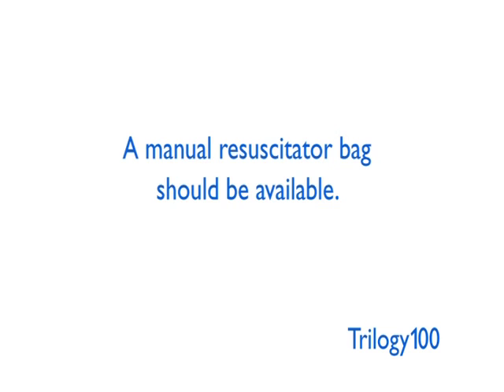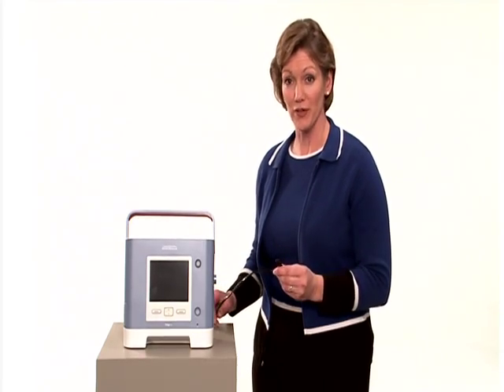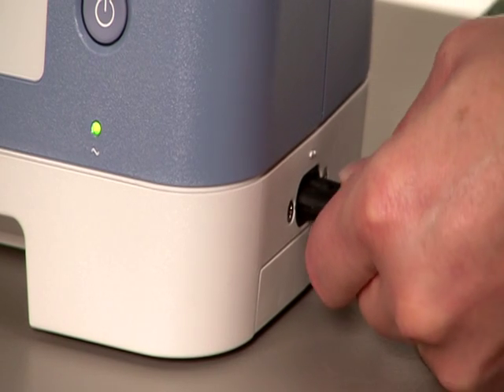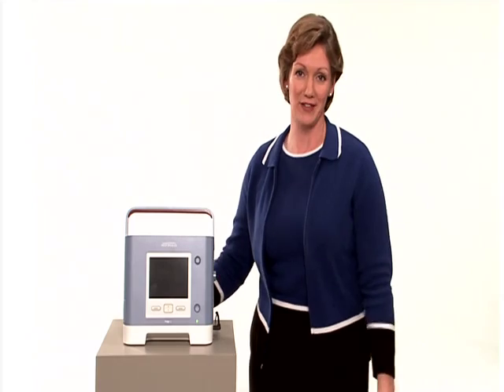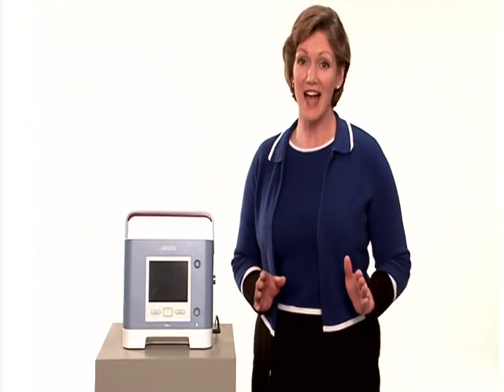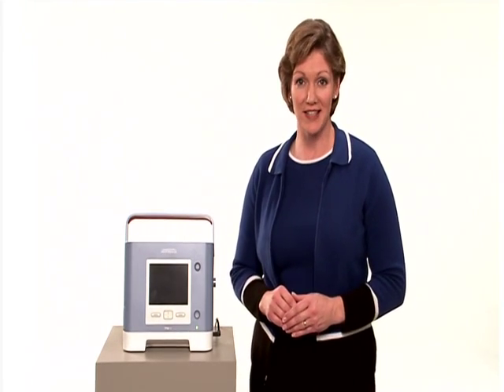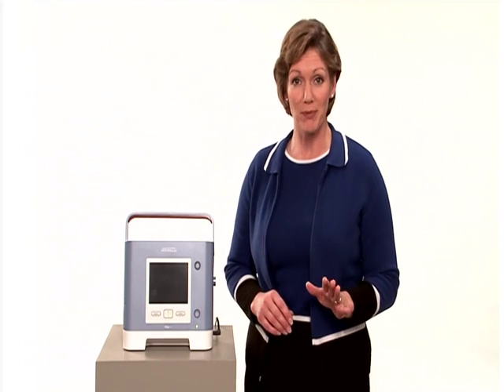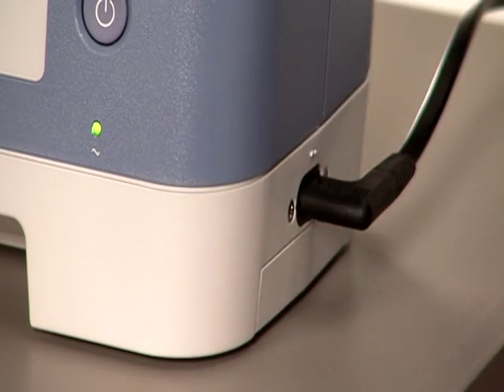A manual resuscitator bag should be available for use just in case there is no power available. To use AC power, plug the socket end of the power cord into the AC power outlet on the right side of the device. Plug the pronged end into a wall outlet. The ventilator must be connected to a wall outlet that is not controlled by a switch. You'll know that the AC power is connected and the device is operating properly when the green AC power LED on the front of the unit is on.